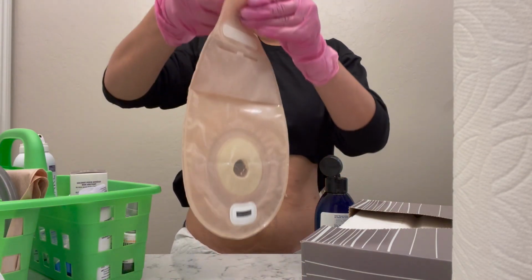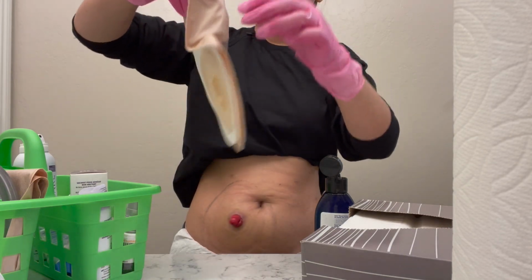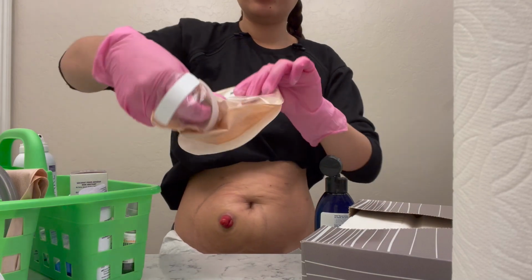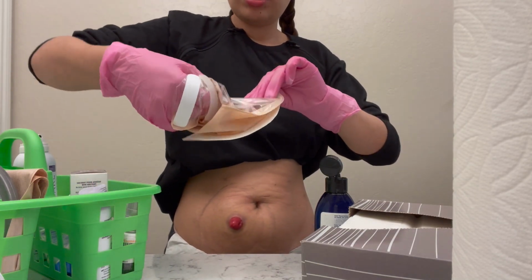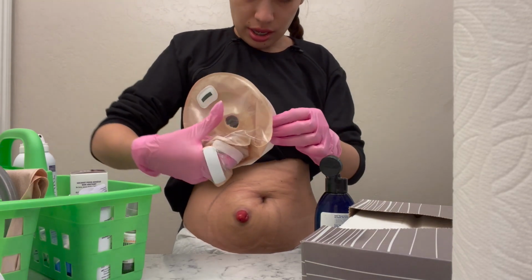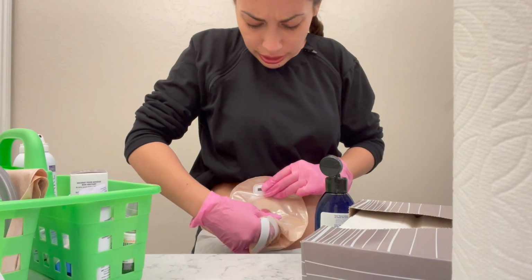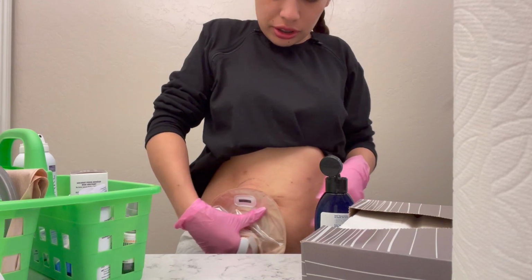And I like to open this entire thing, put air in there, and I'll show you why. So then I hold it like this so I can put pressure on from the inside. And okay, so now I just tuck it up against the bottom. That's pretty good right there. And just make sure that you're standing up straight.